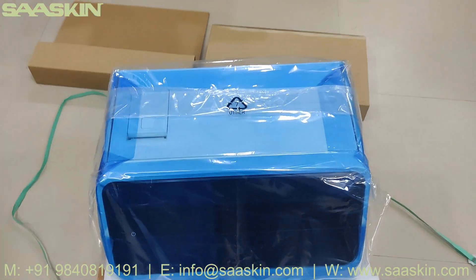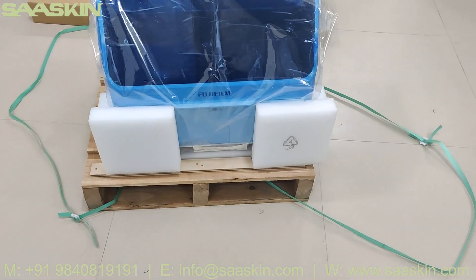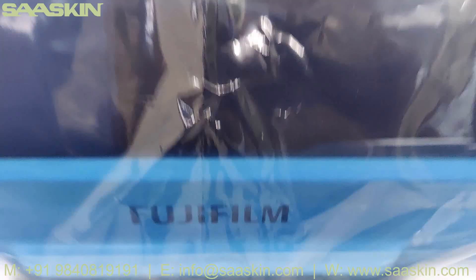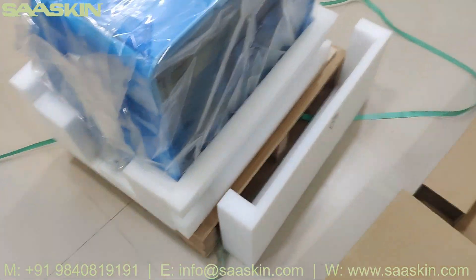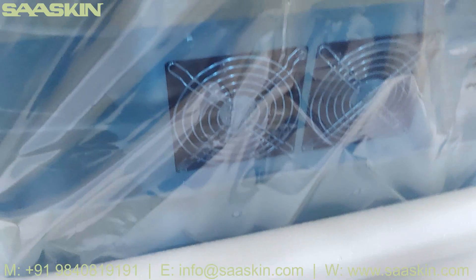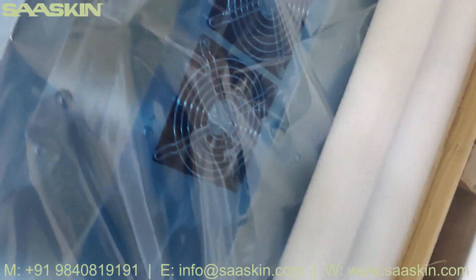You can see this is how the whole machine looks like. This is Fujifilm. Just open this box for you.